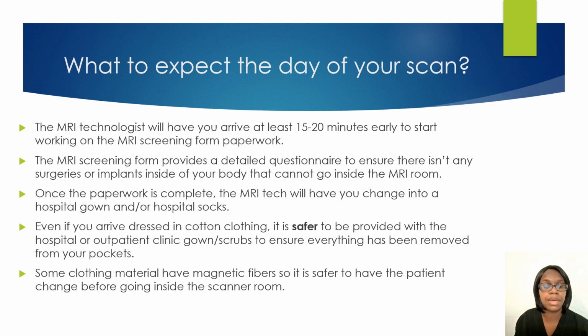I wouldn't go by the patient's answer, just verify that they did mean to mark or select something, because there was a time a patient put they did not have hearing aids, but they did. So you always want to make sure that the patient is filling out the questions correctly. Whenever they do come, you want to make sure that you change them into the MRI clinic or hospital gown or scrubs, just to make sure they have removed anything and everything from their pockets and that they have material on that is safe for them to have the MRI scan.